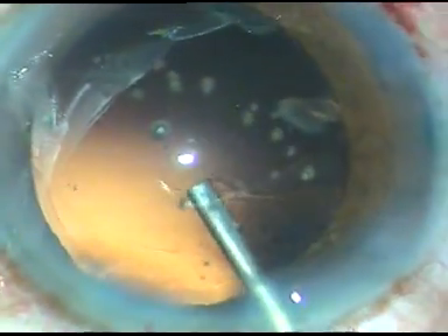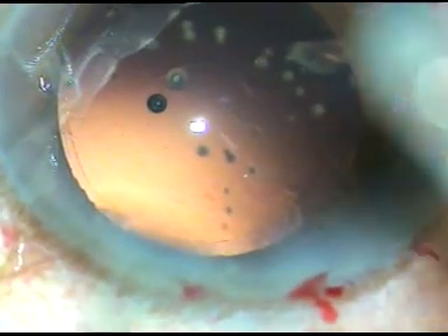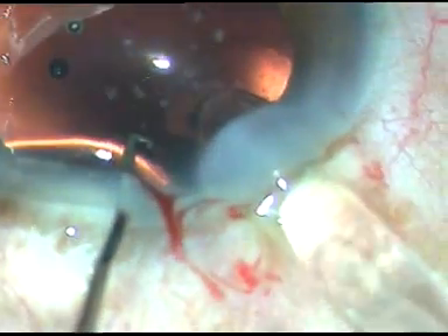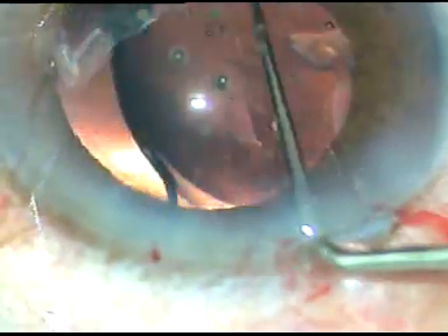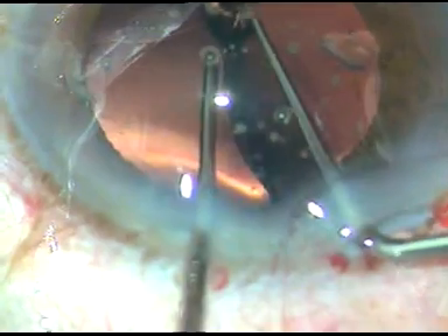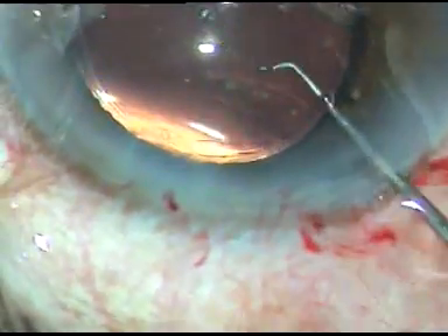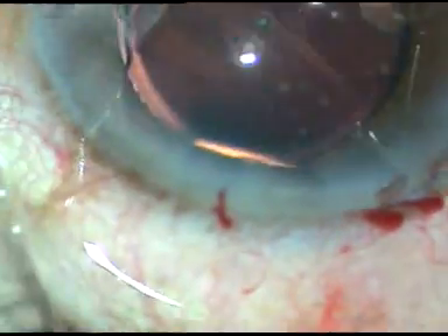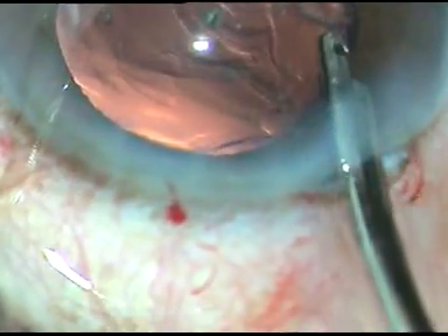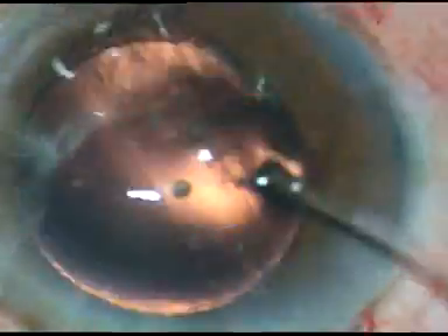There's a small nuclear or epinuclear piece near nine o'clock — it will come out. The lens is being implanted in the capsular bag. It's a foldable intraocular lens — hydrophilic acrylic intraocular lens. The patient belongs to our free service category and we could not afford to give a hydrophobic IOL in this case. The small nuclear or epinuclear piece came out just because of irrigation.